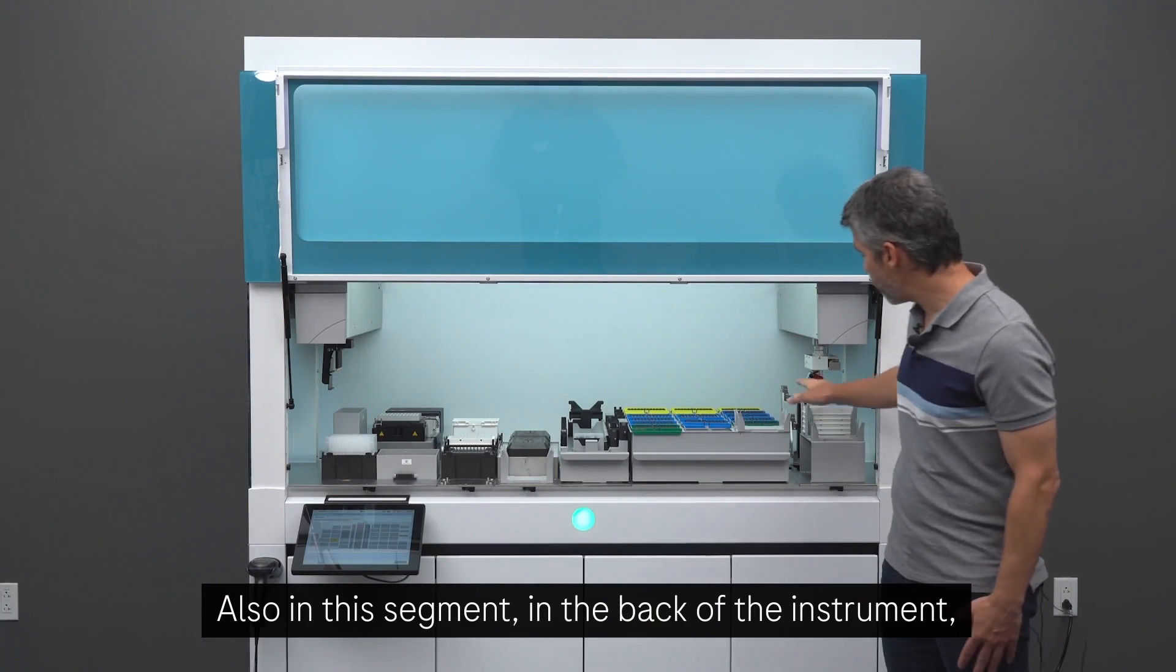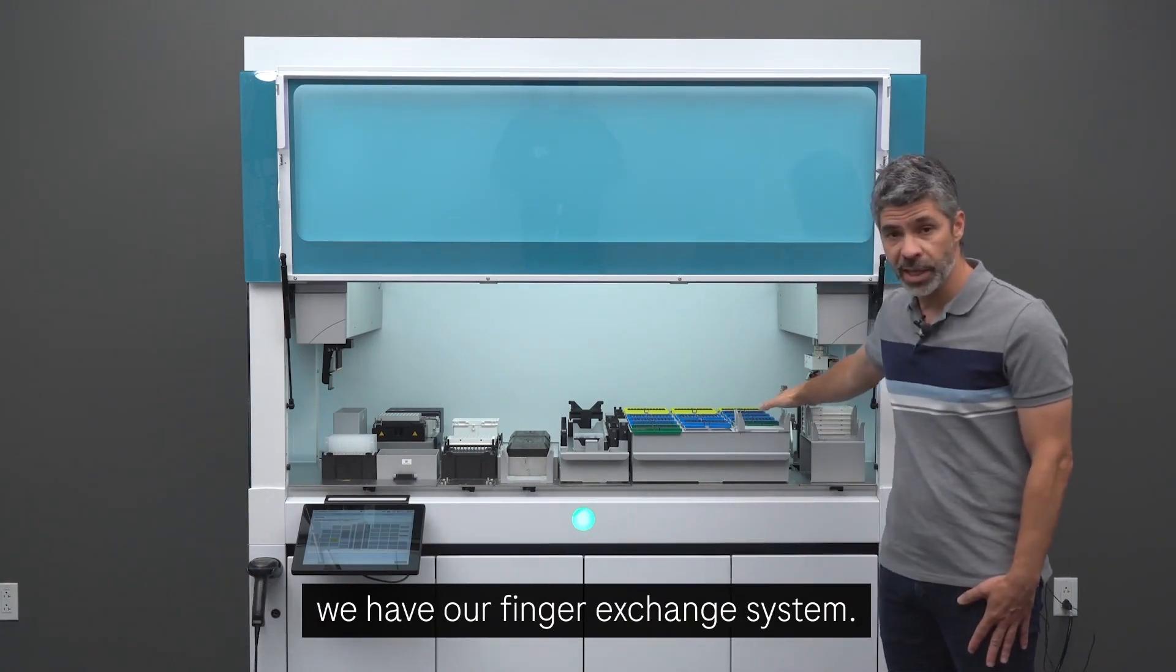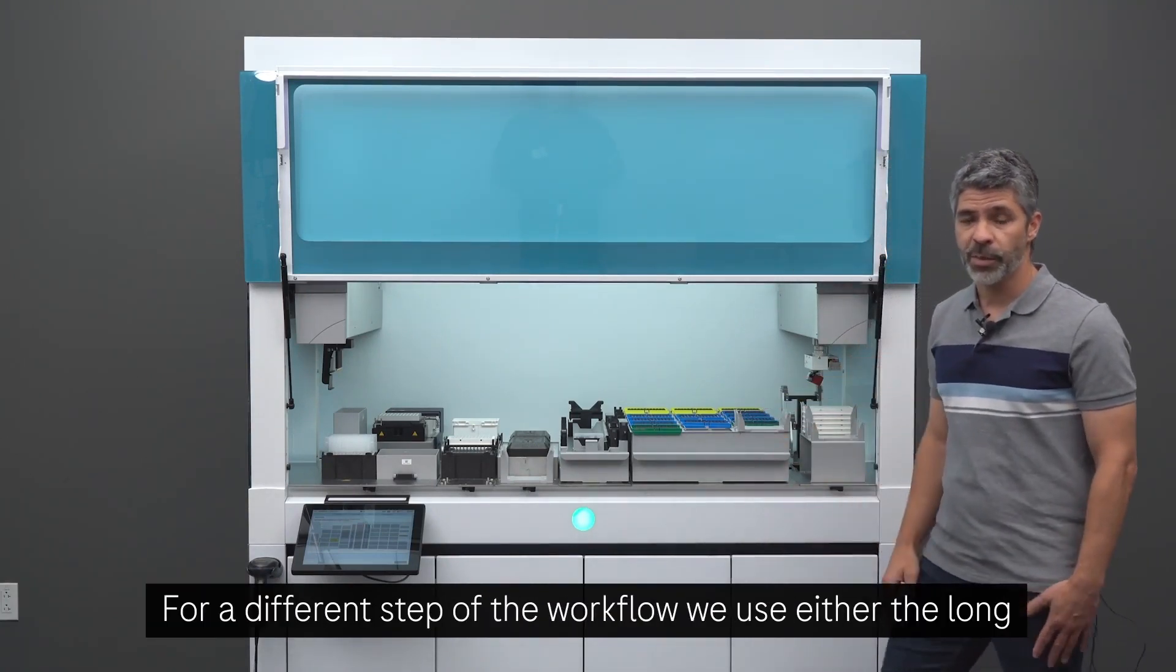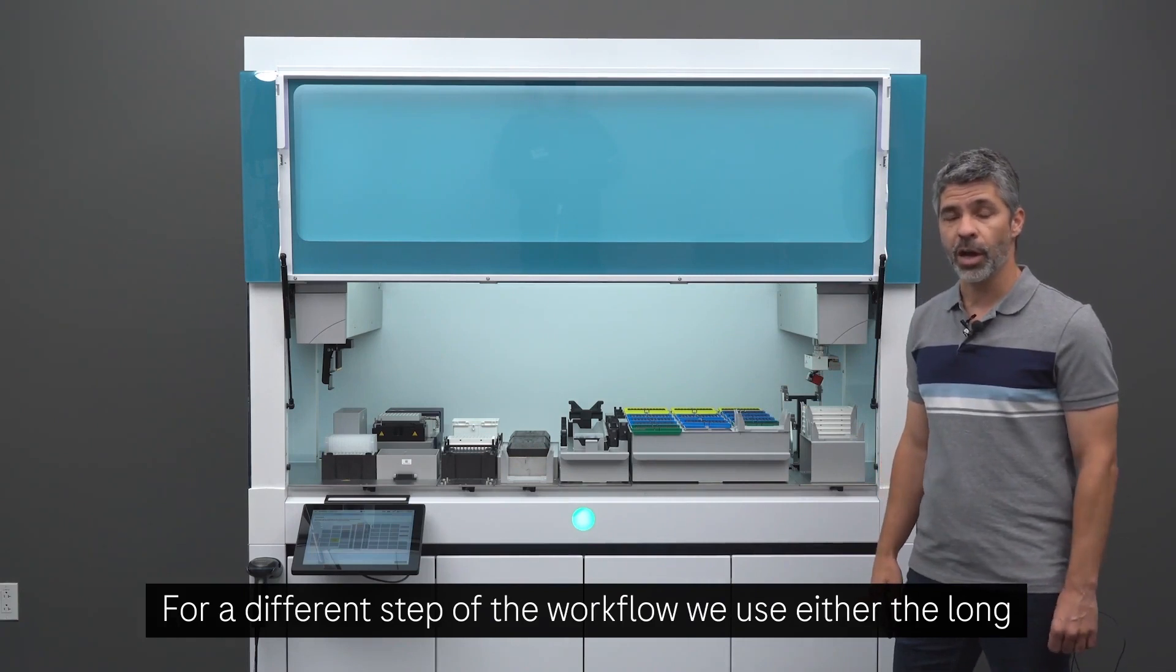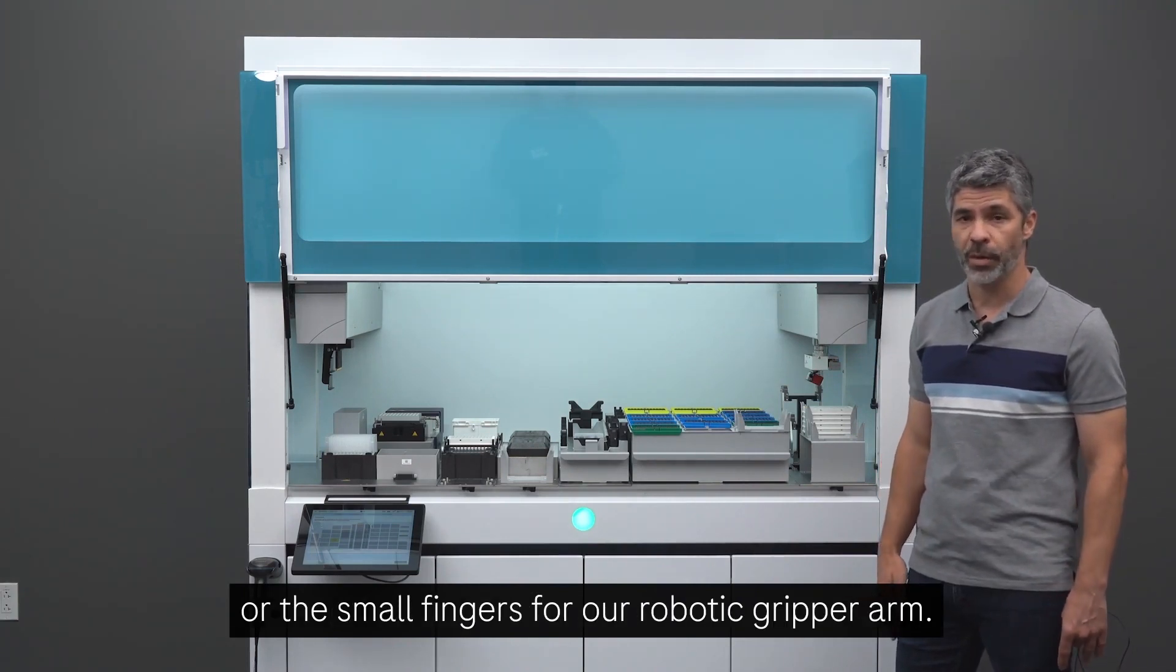Also in this segment, in the back of the instrument, we have our finger exchange system. For the different steps of the workflow, we use either the long or the small fingers for our robotic gripper arm.